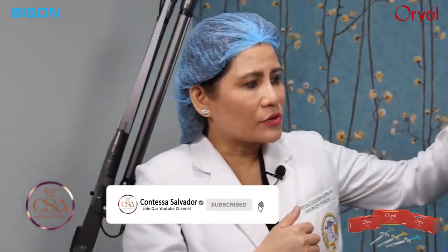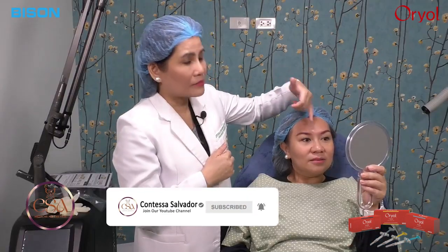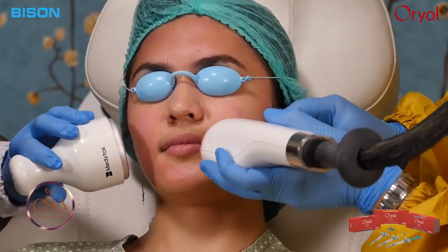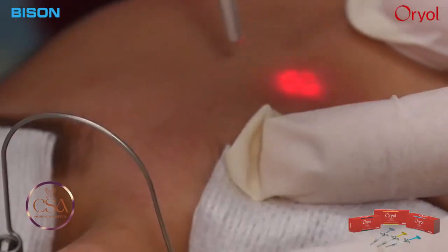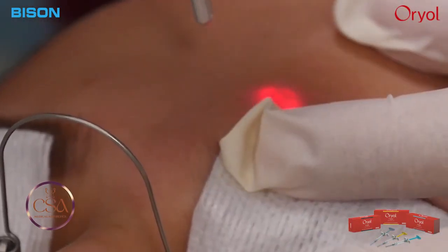Because I was looking also at Maureen's skin. Actually, I still see a minimal, etched line there. Or some will have, on the glabella skin, enlarged pores. It's also good to use other devices, for example LaserMD, thulium fractional lasers, or even the MDF of the Hollywood Spectra, we can treat them. So it's already a combination treatment for those who have severe glabellar static, permanent, fixed lines.